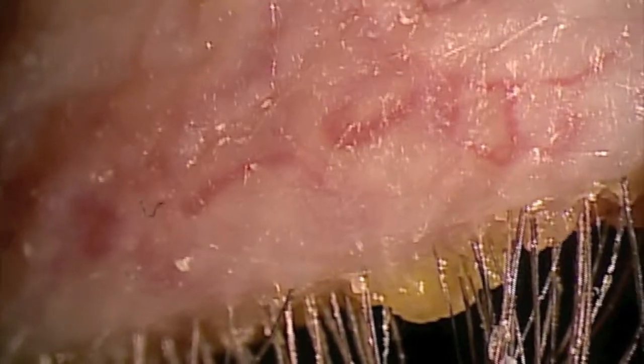Here we present a patient with three to four plus chronic blepharitis, just prior to a cataract procedure. To lower the potential risk of endophthalmitis, we know that it is important that this bacterial crusting and debris be removed prior to surgery.